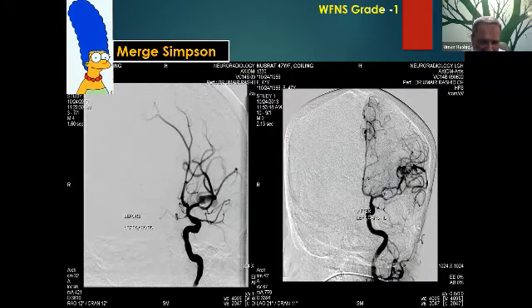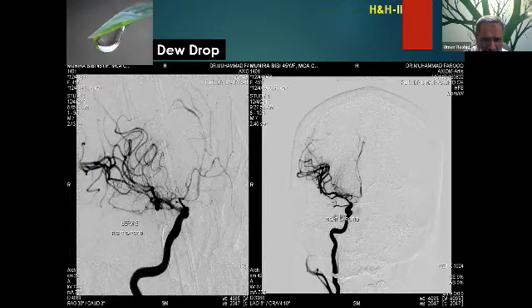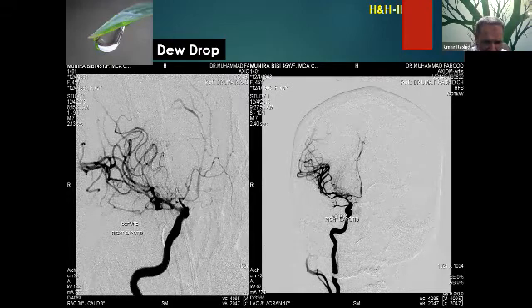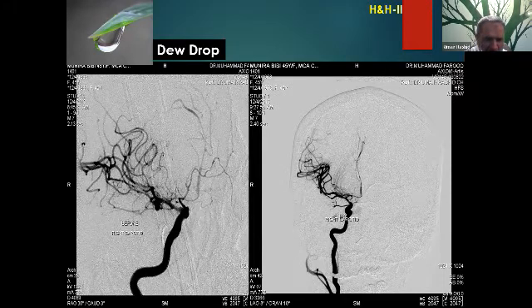You could see different shapes. I'll show you different shapes, taking the MCA aneurysms, and how they change with the perianeurysmal architecture after the subarachnoid hemorrhage. This one is giving you this sort of shape, and you can safely decide the type of coil which you can fit with this aneurysm, which we did on the right side; you could see it after the coiling. So it's another drop shape. Although it's very difficult to do without a stent-assisted technique, if you're comfortable selecting the proper coil for it, you can safely do it, which we did, and it worked very well.